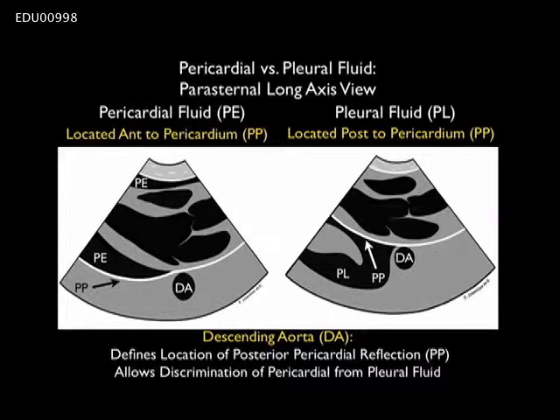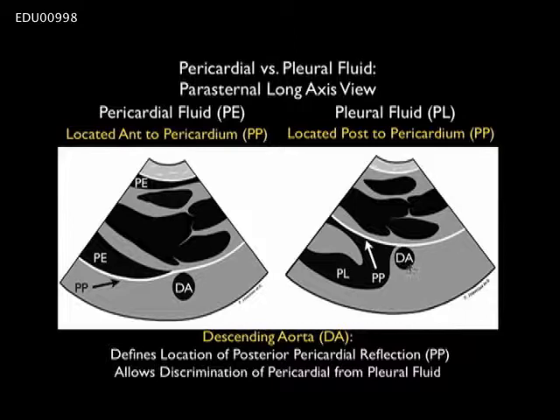This illustration reinforces the difference between pericardial and pleural effusion from the parasternal long axis view. In the left image, fluid layers out anterior to the descending aorta and posterior pericardial reflection — therefore within the pericardial sac. In the right image, the fluid is posterior to both the descending aorta and the posterior pericardial reflection, and therefore within the pleural cavity. These are very important landmarks when trying to figure out if fluid is pericardial versus pleural.